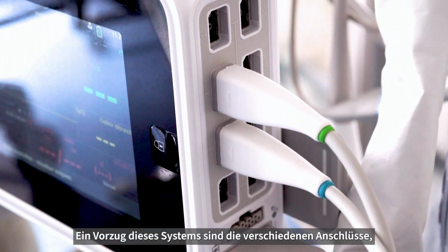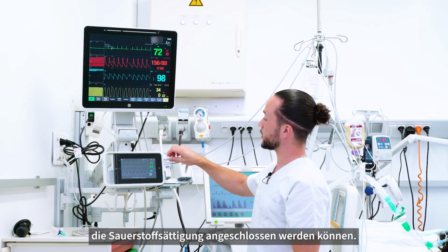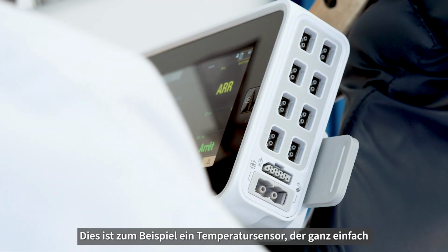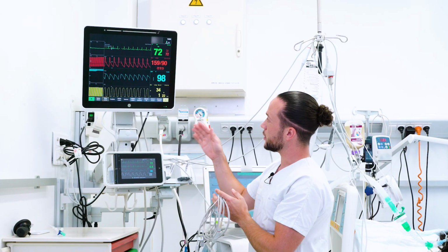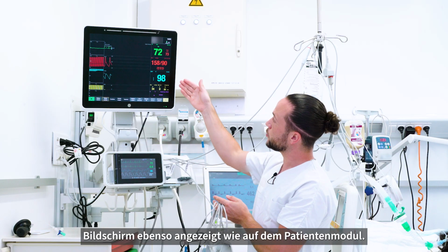The great thing about this device is that you have multiple connectors where you can connect multiple invasive pressure or oxygen saturation monitors. All these ports are universal. This one, for example, is a temperature probe. Just connect it here or anywhere else. The temperature monitoring will be displayed on the screen, whether it's portable or not.